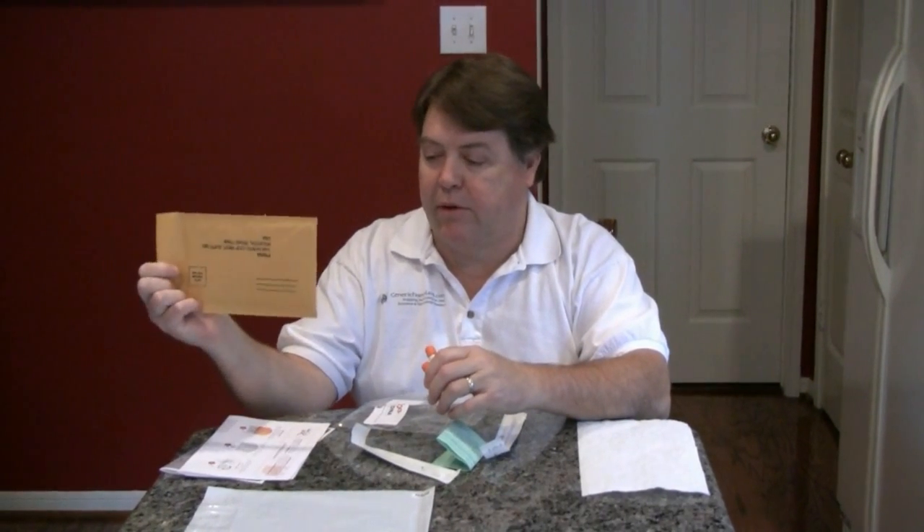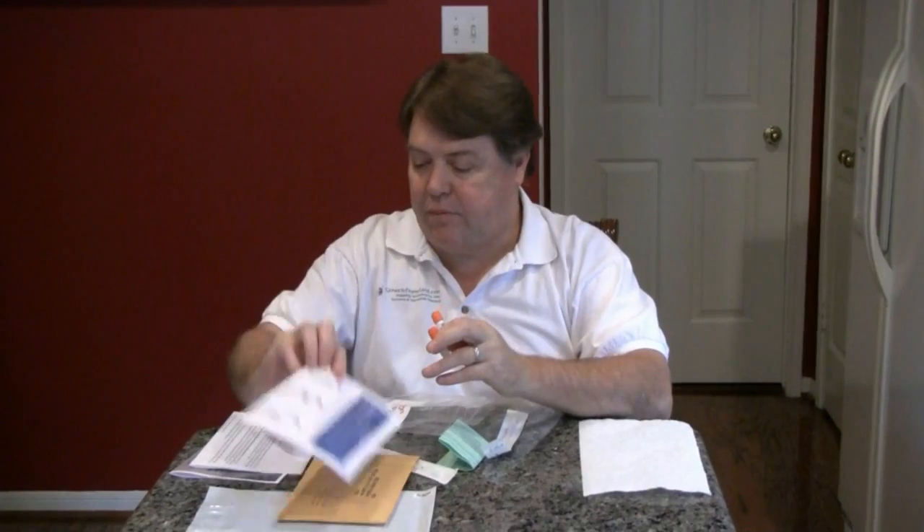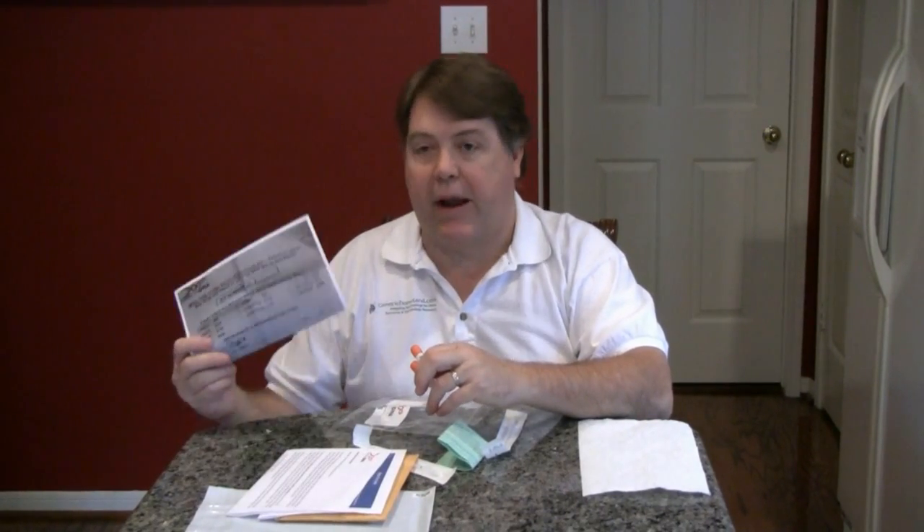And also a mailer to mail it back. You've also got printed instructions from the lab, which you should read, a welcome letter from Family Tree DNA, and you may or may not have an order form depending on how your test was ordered.